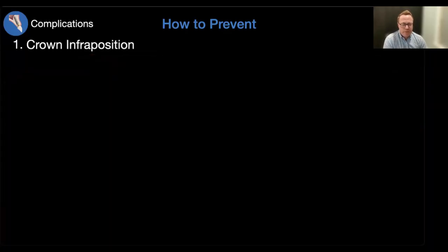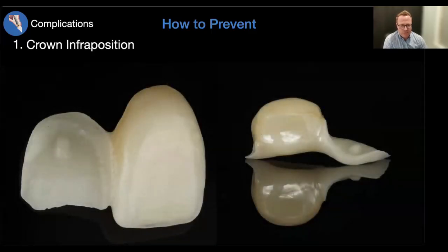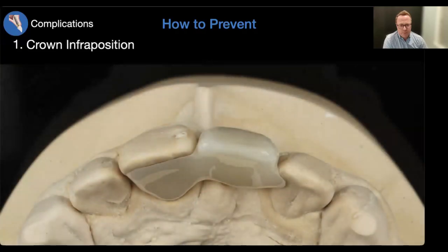So what we're going to do is a resin bonded prosthesis, or a Maryland bridge. And here you can see just an example of that. This is a zirconia substructure, facially layered to help match the aesthetics of the adjacent tooth. And then this is going to be bonded on to number 8. There's not going to be any bonding to number 10, but just to number 8.